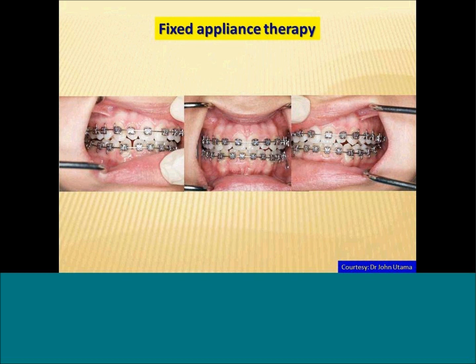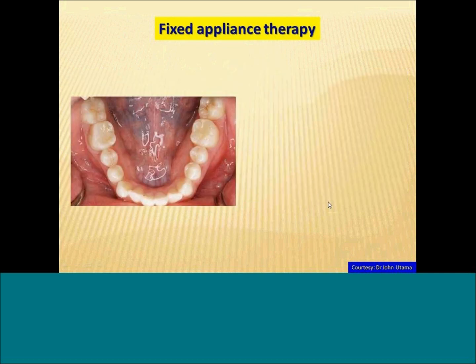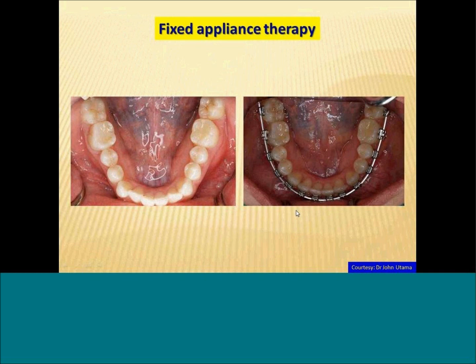Here you see the full brackets all in place. We can see, starting from the original position, how this patient's arch is being redeveloped — both from a bony point of view, a dental point of view, and also from a pneumopedic point of view, meaning the underlying airway is also being addressed. We also see in this case how the lower arch has become more symmetrical and the teeth have become more well aligned.